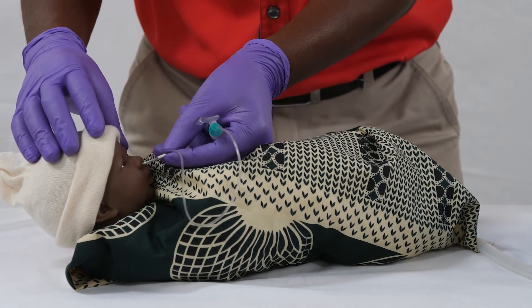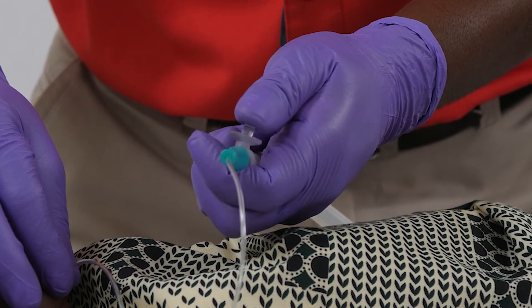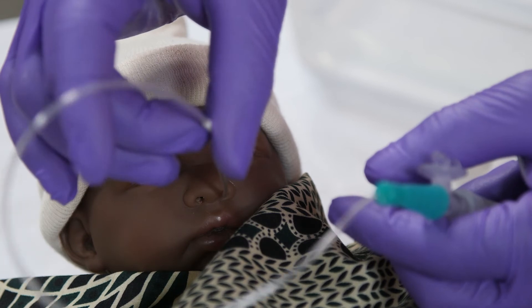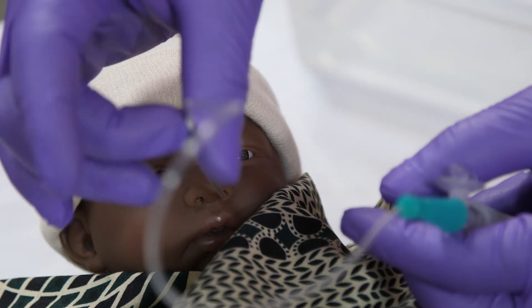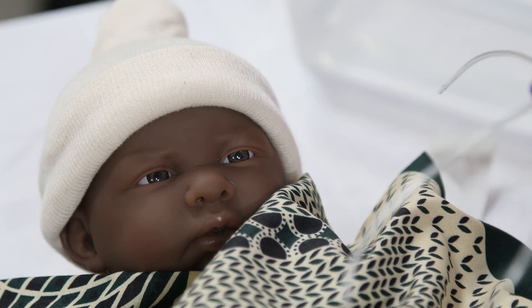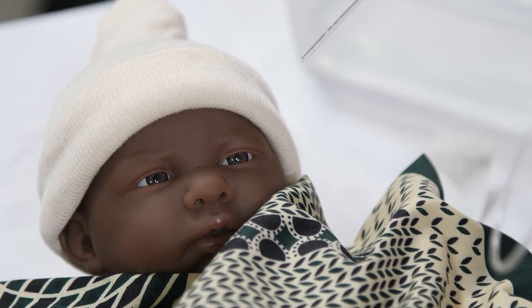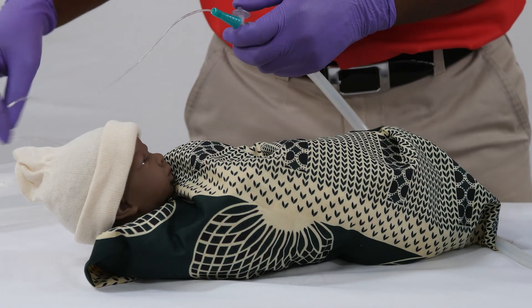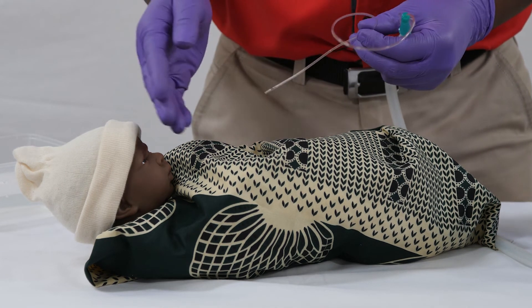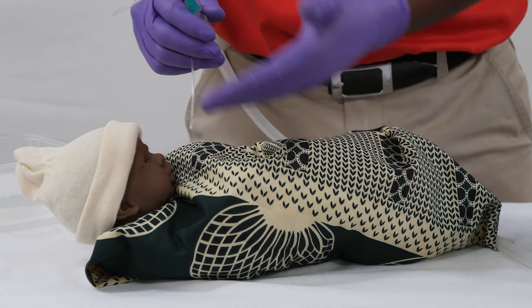Close the hole to start suctioning. Insert the tube, close the hole to start suctioning, and slowly withdraw it. At the end, check what you have suctioned in the bottle. Check that there are no other secretions that need to be suctioned and that the baby is breathing well. If there are no more secretions, then the baby will have cleared airway.